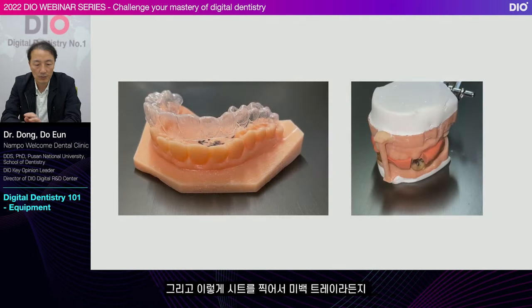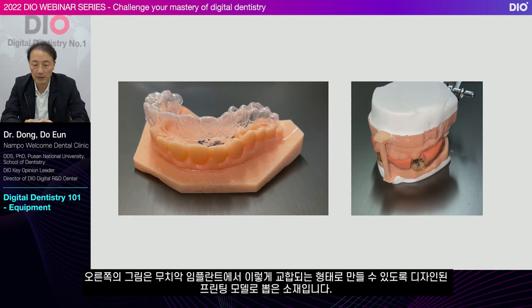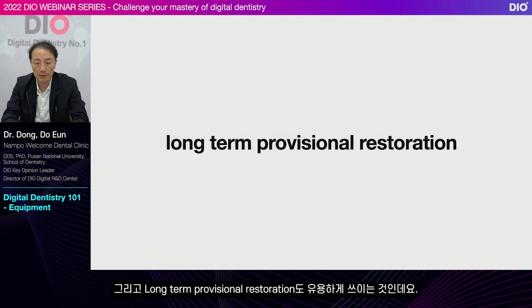Also, you can capture a sheet like this to make things like whitening trays or transparent orthodontic devices. The picture on the right is a material selected for the printing model designed to create this occlusal shape in an edentulous implant. And it's also useful for long-term provisional restoration.